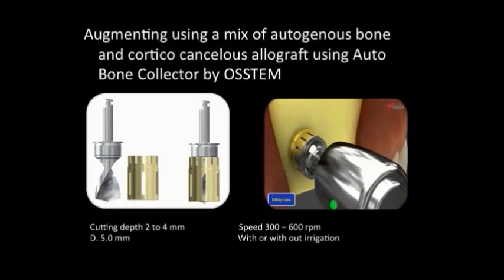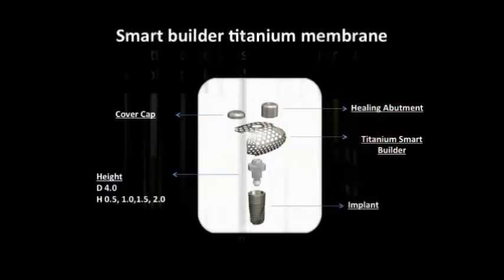It's a Korean company, and the tool is not that expensive, so it's not difficult to get it anywhere, and usually you can use it a few times. The company usually recommends using it 50 times. Sometimes I use it more than that. It depends on how much cutting you can see the collector is cutting into the bone, and you can always re-sterilize it and use it again. So it's reusable, it's not disposable. So it's not a cheap tool that you can use in the clinic a few times.